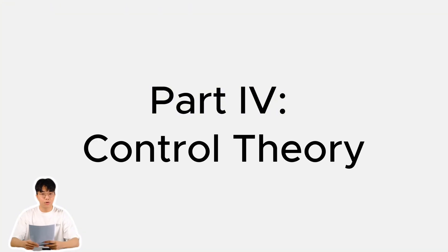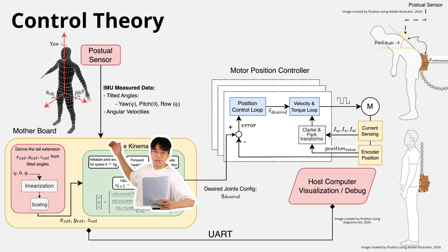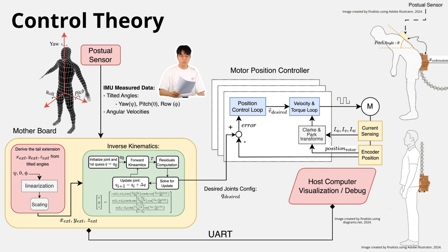So how does our system work? First, our system detects body tilts using an inertial sensor, processes it through linearization, scaling, and inverse kinematics to calculate the needed tail extension. The brushless DC motor adjusts movement with a closed-loop motor controller. With real-time feedback, our tail dynamically stabilizes the user for instant balance.